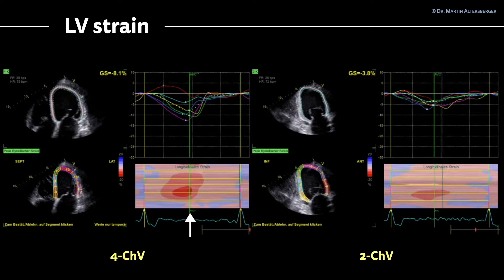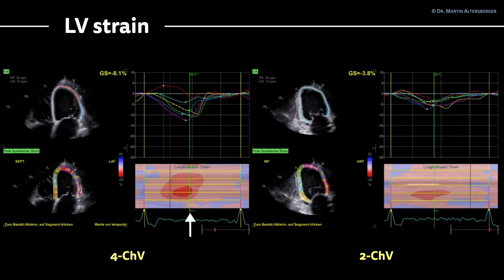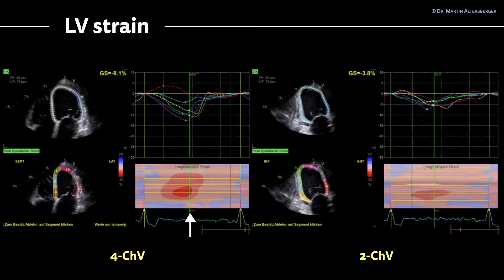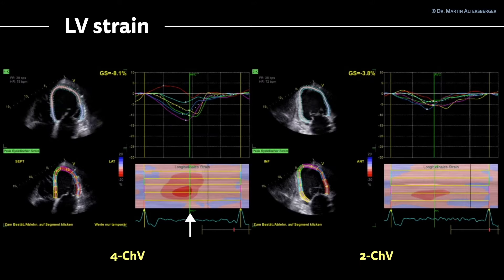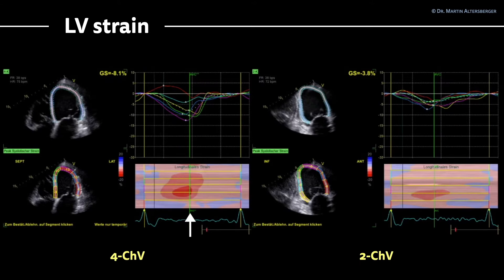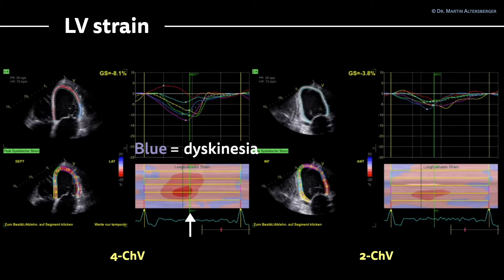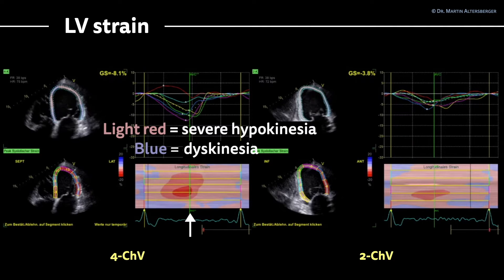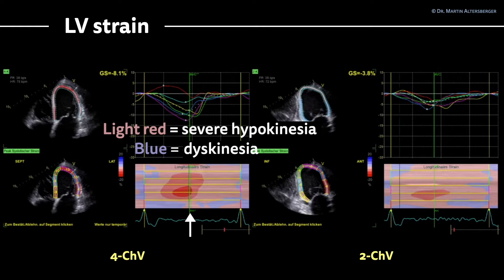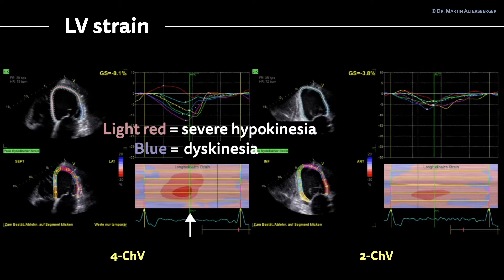In the strain M-mode, on the bottom right of the first loop, we see a lot of light red color, a little bit of darker red color, and a very small area of really dark red color, and even some blue color. The blue color represents dyskinesia, the light red color represents severe hypokinesia. The darker the red becomes, the more contraction is actually happening.